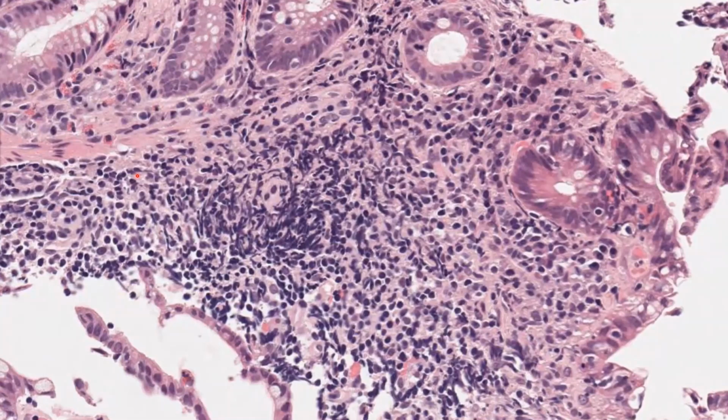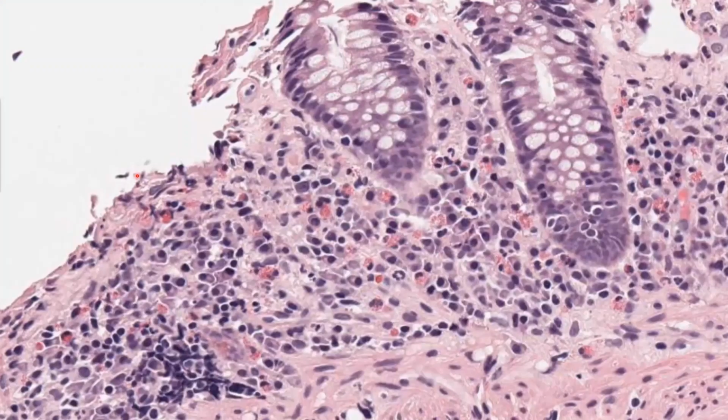And this is important when you read these entities, especially in the microscopic colitis areas, that you need to know the difference when we use the phrase increase in intraepithelial lymphocytes, because this is diagnostic for lymphocytic colitis, for example. For lymphocytic colitis, yes, you need the 25, the 30, but let's say you have 15, right? So that 15 is only an increase in intraepithelial lymphocytes, but it is not diagnostic for lymphocytic colitis, yes? So just remember the difference in the terminology between the two.